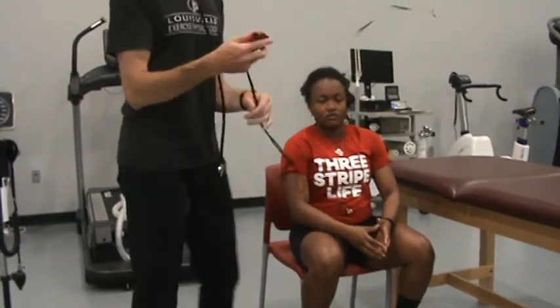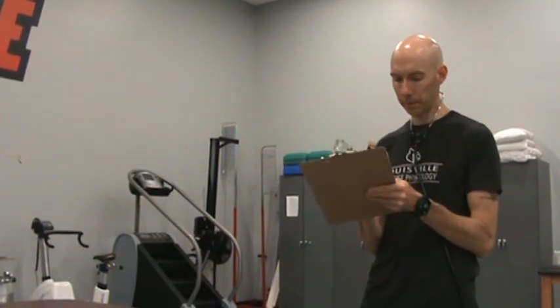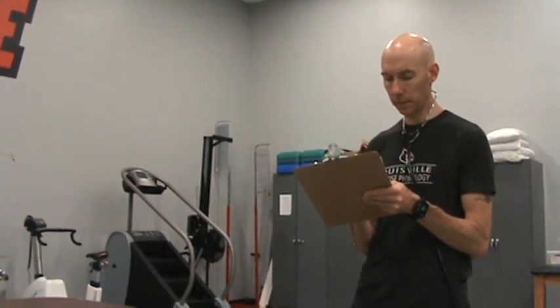So I counted 25 beats in 30 seconds, which would multiply by 2. That would give us 50 beats per minute. So her heart rate went down a little bit from supine to seated. We'll talk about that pattern here momentarily.